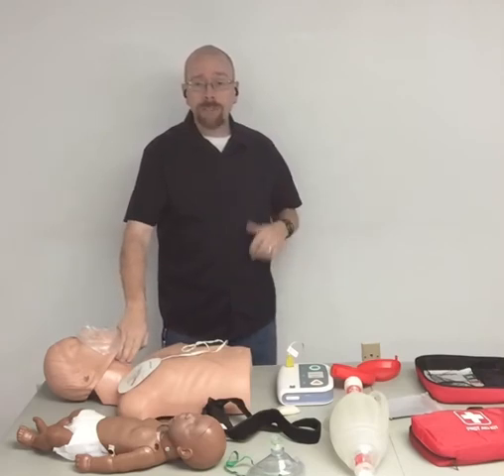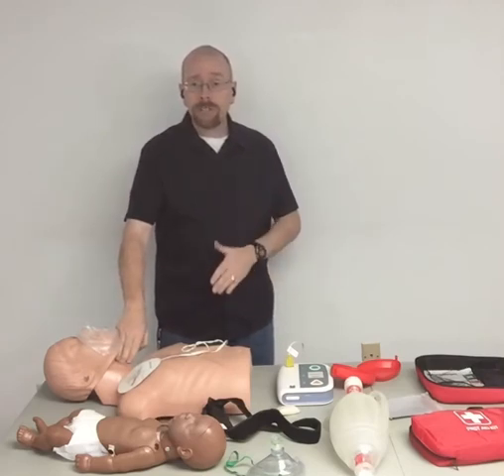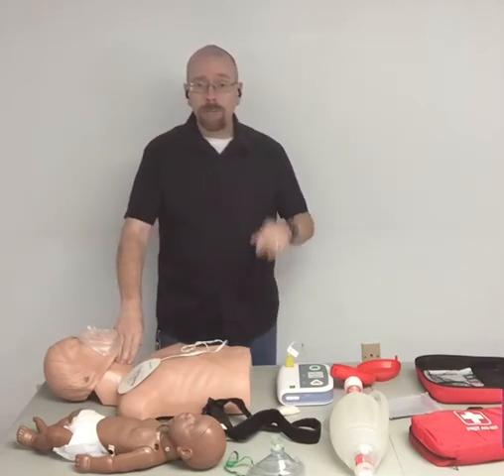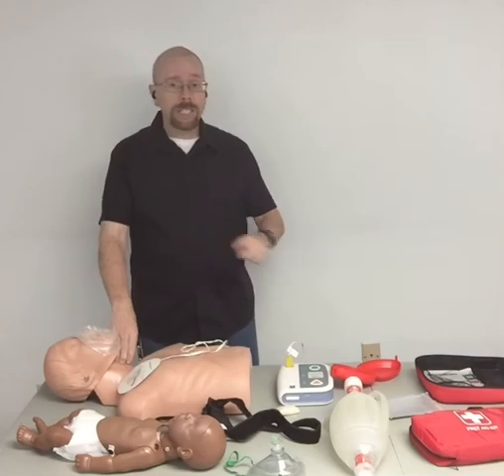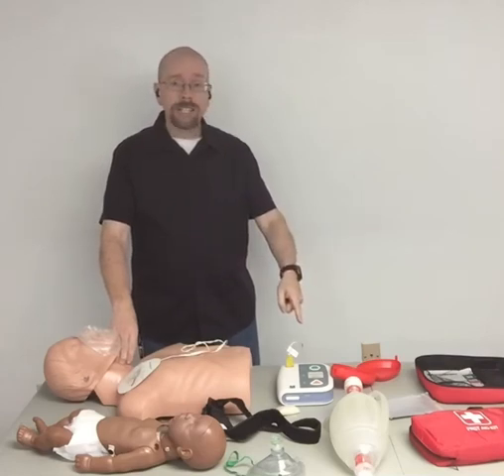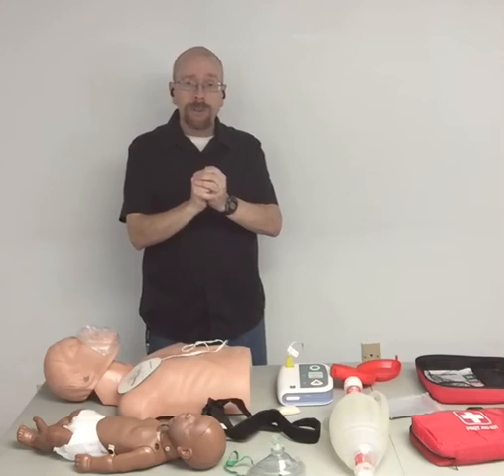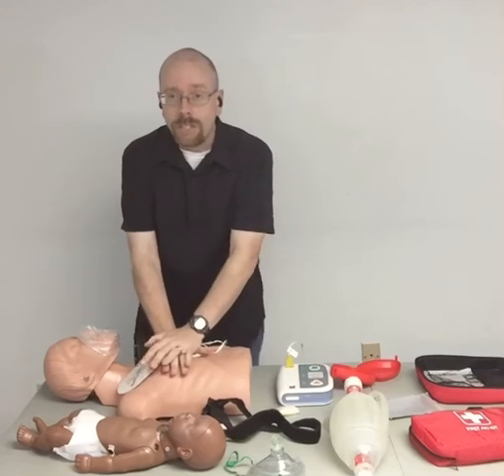If there is a pulse, great. Just monitor the patient, maybe put them on their side in the recovery position, that way if they happen to vomit. But if there's no pulse and the defib is actually saying no shock indicated, the heart may have stopped completely. In those situations, this isn't going to start that stopped heart. So we just have to go back to doing CPR.